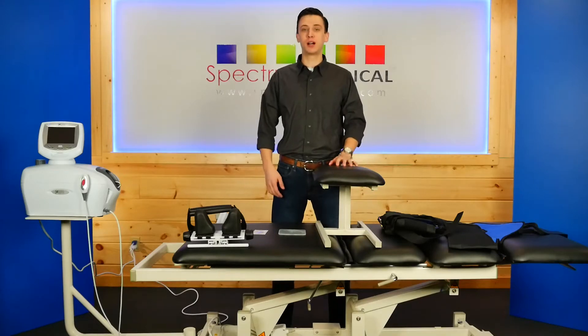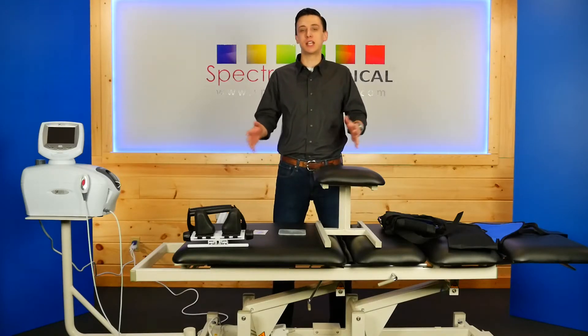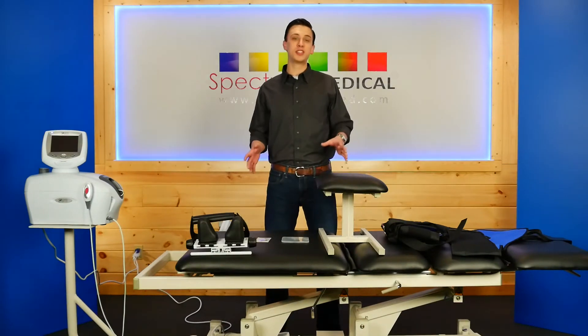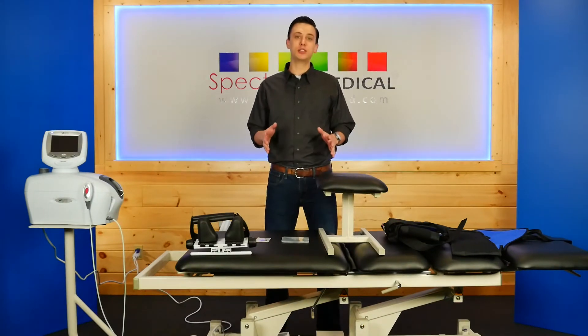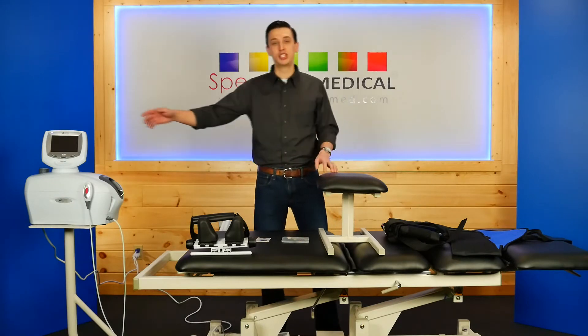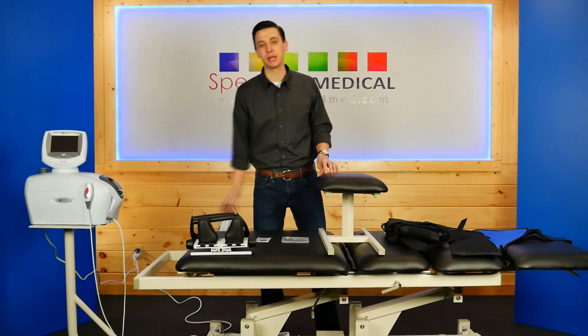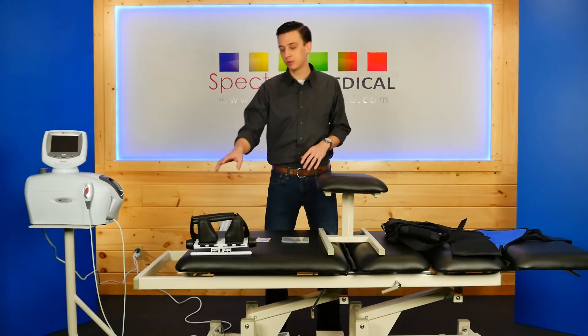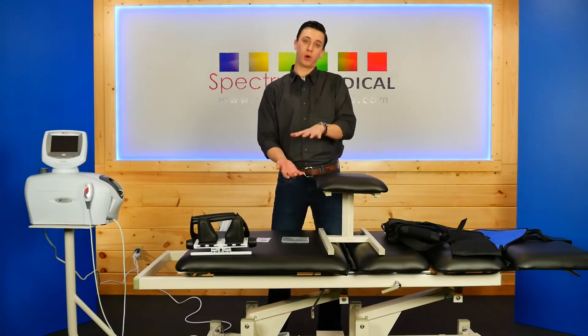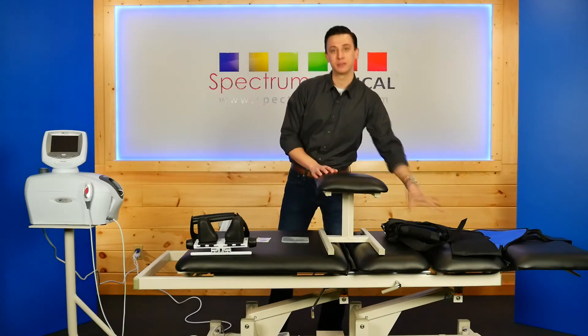Hey, Brandon Dillbeck, Spectrum4Med.com, and this is our complete decompression system. With this system you're going to get everything you need to do both lumbar and cervical decompression, starting with the Chattanooga TX Traction Head and Elevation Traction Table, Saundra Cervical Device, Flexion Stool for doing lumbar decompression, and a lumbar belt system.